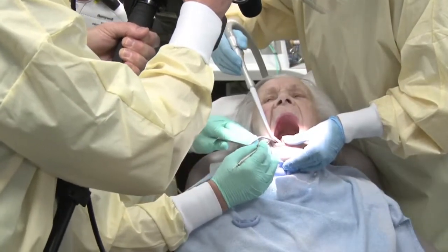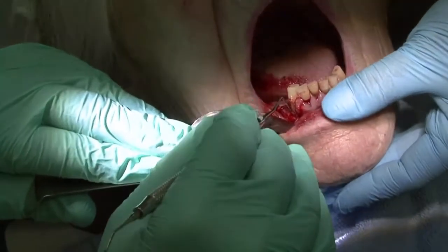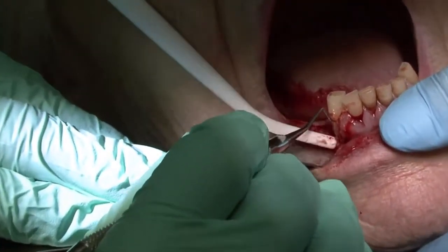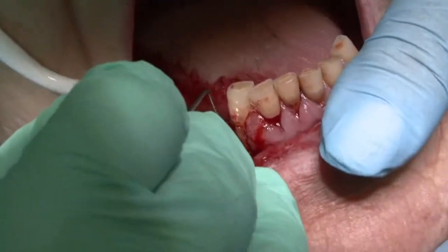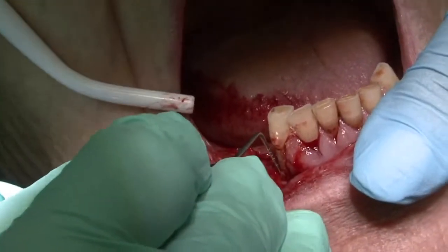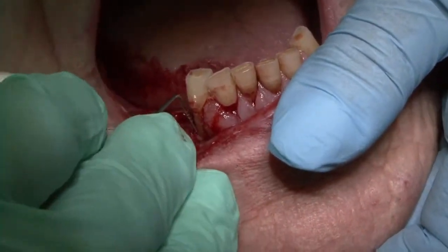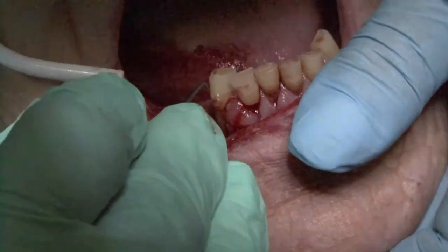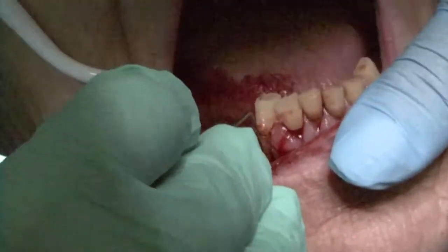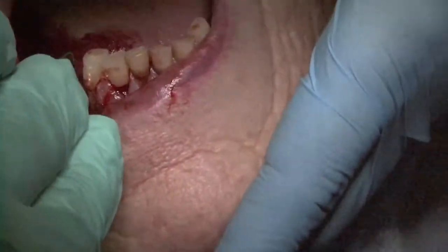I think you all can see something that we didn't expect to find here. There's a defect right here on this side, and it's adjacent to where we're placing the implant. Since we have this area exposed, we're going to do a curettage of this area, and we're going to place some Emdogain and some bone in this area at the same time. That way we can help keep this tooth a little bit longer.